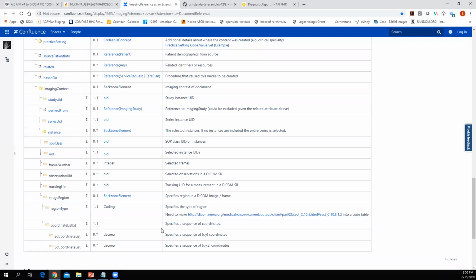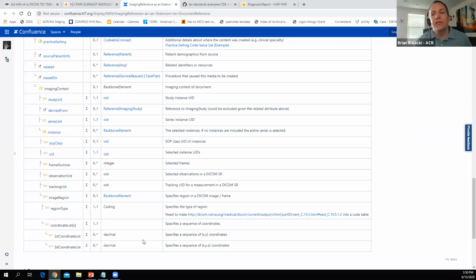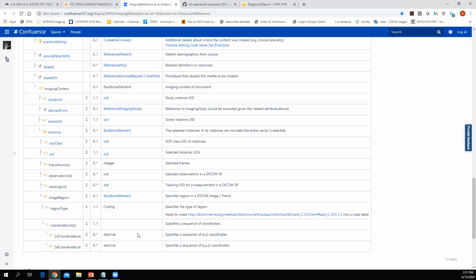But the GSPS may contain more than a single image. It may also contain multiple markers. Yes, but today I can call that without the extension. I only need the extension if I want to place coordinates on a particular image. And obviously I wouldn't be able to reference a very specific observation if I was calling a GSPS object, which I think gets into some of the issue.